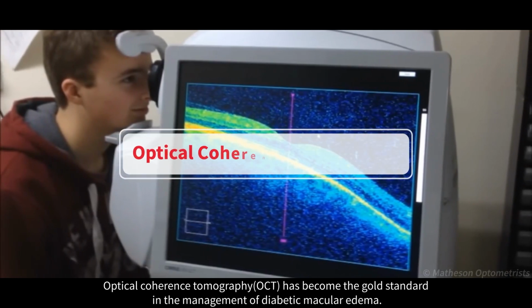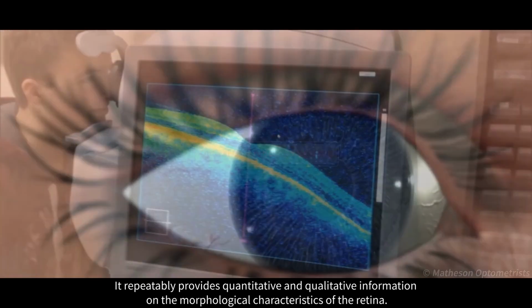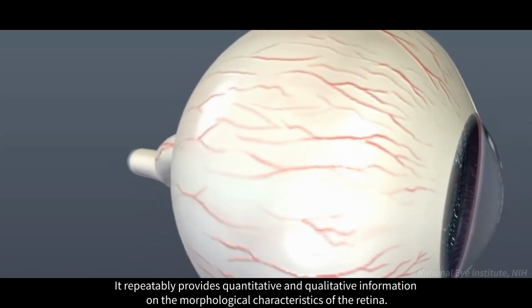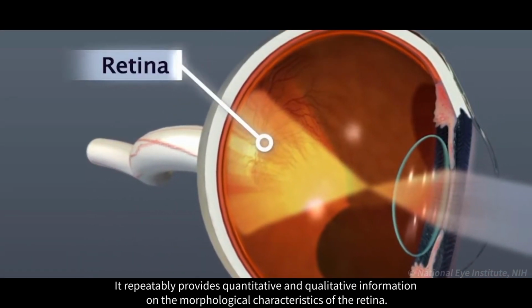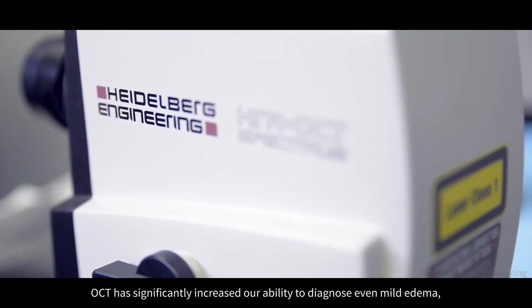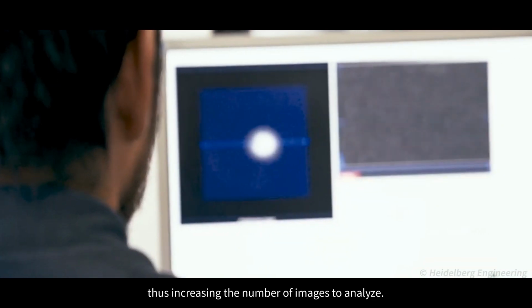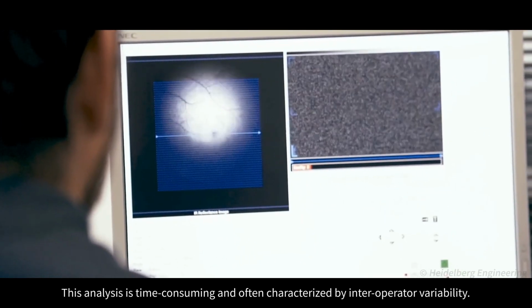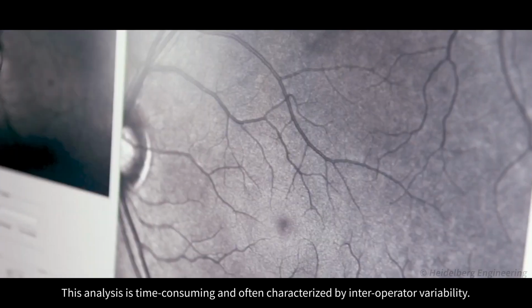Optical coherence tomography has become the gold standard in the management of diabetic macular edema. It repeatedly provides quantitative and qualitative information on the morphological characteristics of the retina. OCT has significantly increased our ability to diagnose even mild edema, thus increasing the number of images to analyze. This analysis is time-consuming and often characterized by interoperator variability.